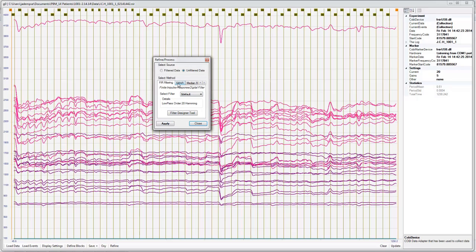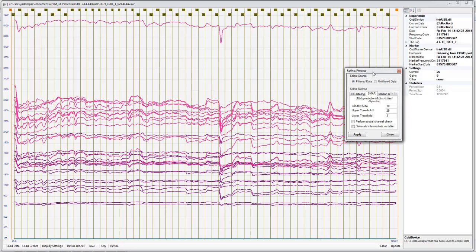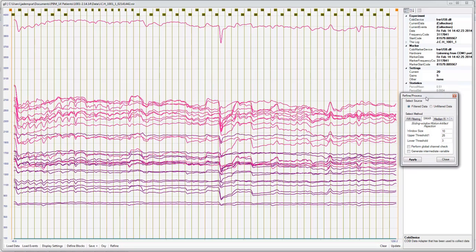Then we're going to use the SMAR function. The SMAR function is only available in the professional version, which we have for our laboratory. So if you're using the non-professional, you won't see this option. But we're going to SMAR clean based on filtered data. Leave all your defaults the same. It's going to reject any information that is moving so quickly that it believes it's not associated with brain activity, but from a movement artifact.